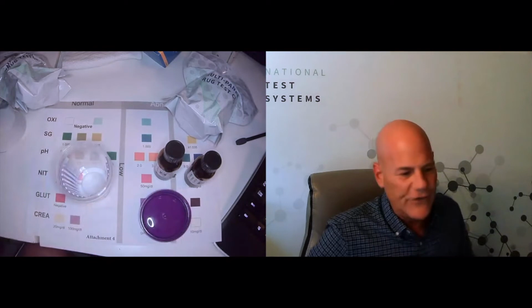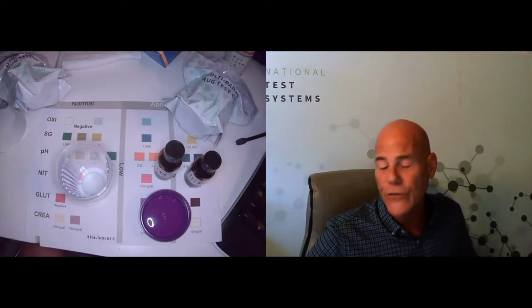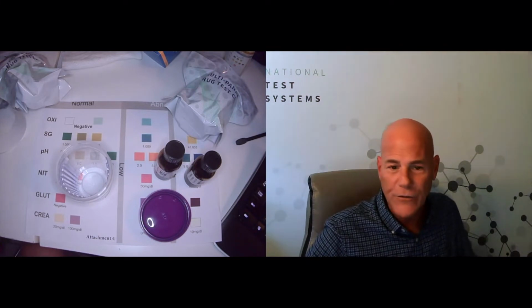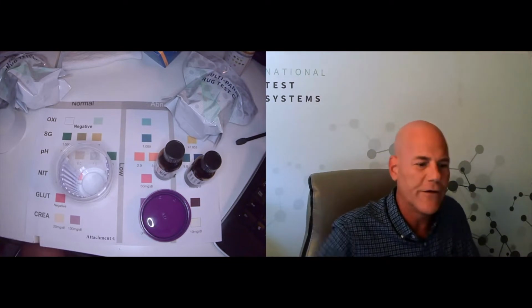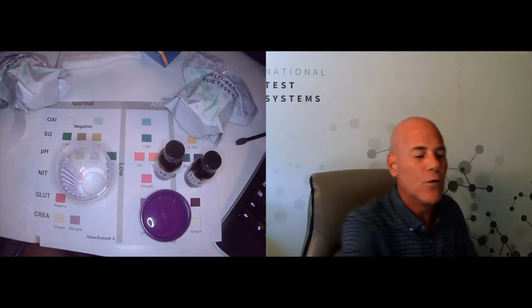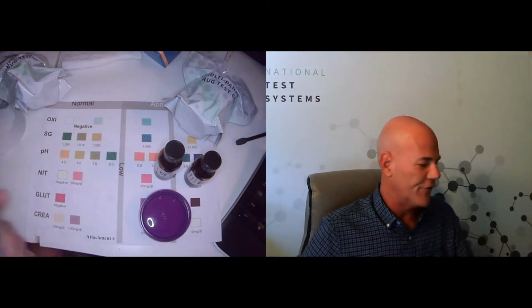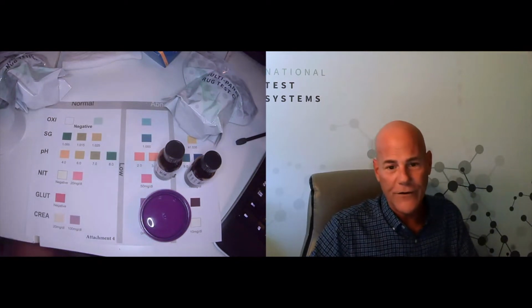So the instructions in the separate adulteration strip, and if you train with me at all about using the cups themselves, you know my rule. You want to read the adulterants at about the 3 to 4 minute mark. You can read them earlier. According to the instructions, for example, on the individual strips, it says to read between 1 and 4 minutes. So with the cup, if you remember my instructions, you read the temperature strip first, and then you go back and read the adulterant after that.